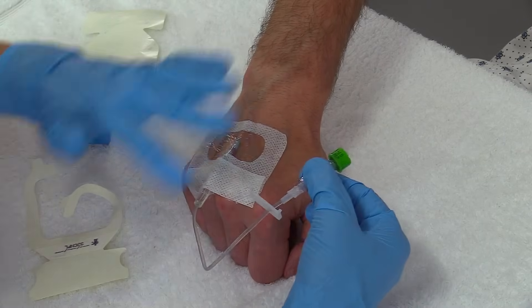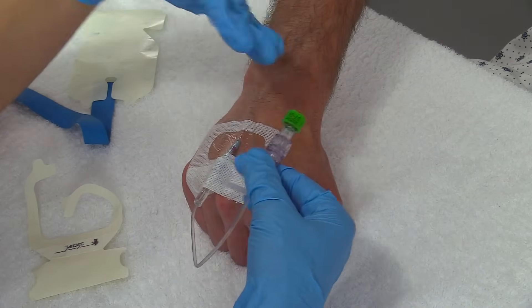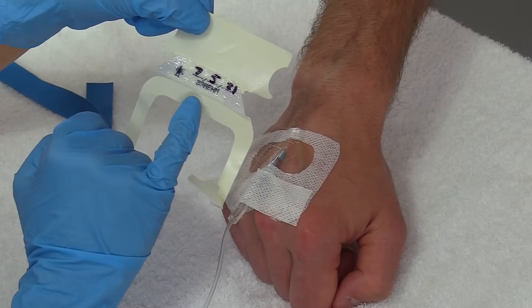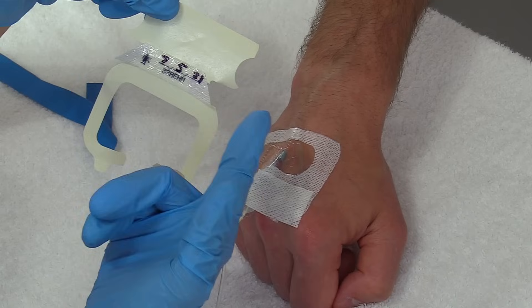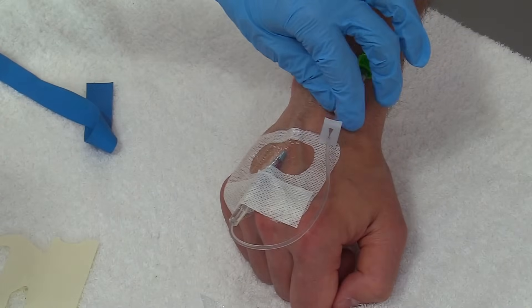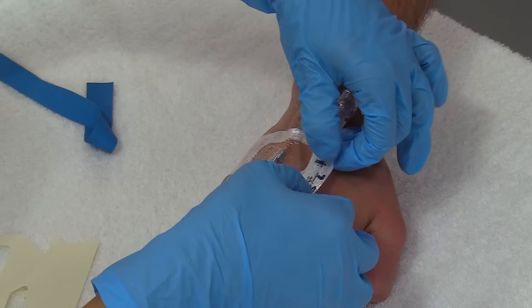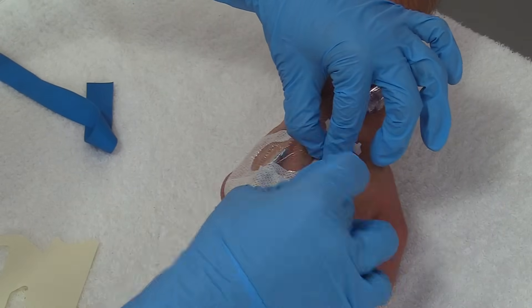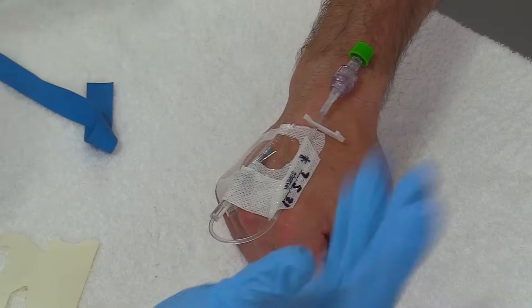With this particular extension tubing, remember the letter J — that's how you want to secure it down. We don't want this flopping everywhere, as that's going to put tension on the IV line and possibly cause the IV to slip out. There's also another piece of tape to secure the tail of the IV. I've already filled it out with the insertion date — put whatever date your facility requires. I'm going to peel that off, put this up in the J shape, lay that there, and slide this piece of tape on this part. Be sure you smooth the edges down so that it sticks, which will help protect that site from falling out and keep it more secure.